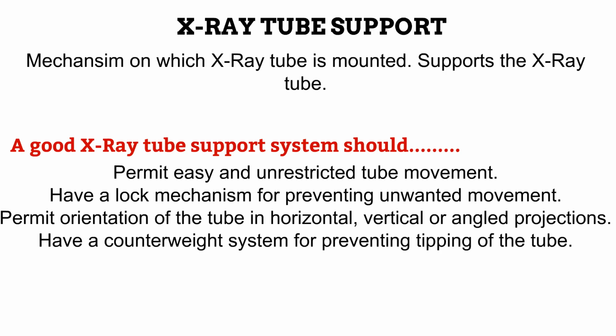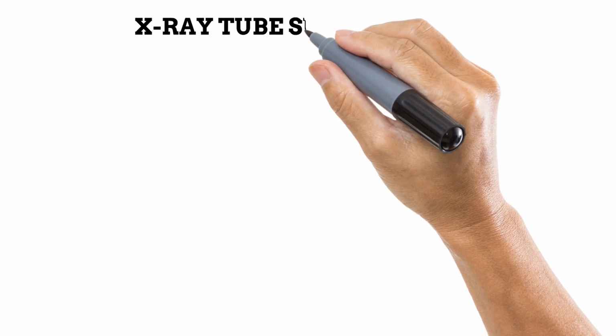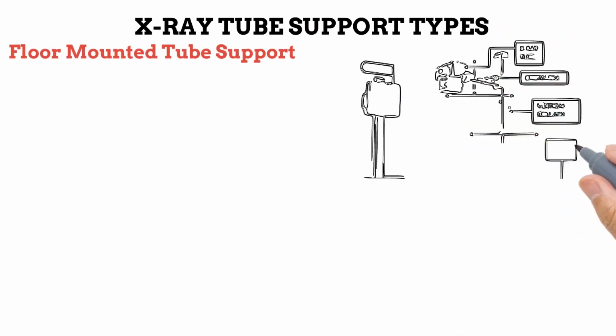A good tube support will also enable the tube to be directed in a horizontal, vertical or angled manner when needed for projections in such directions. There should also be a counterweight system to prevent the tube from tipping over on its weight. There are three common types of tube support systems. The first that we'll be looking at is the floor-mounted system.